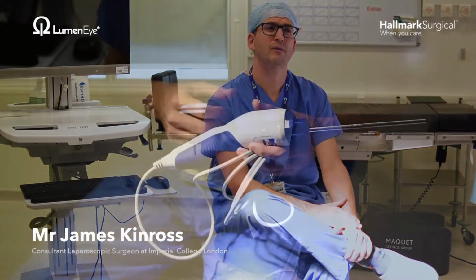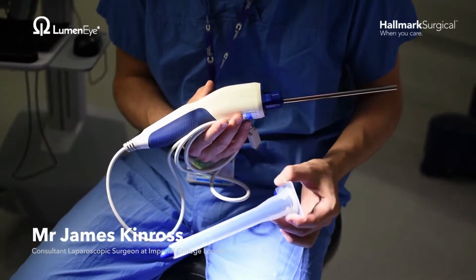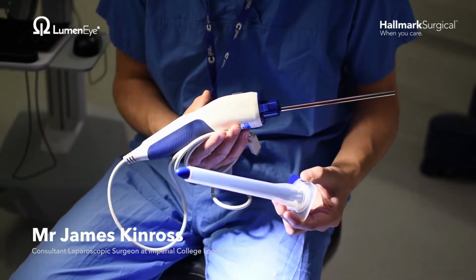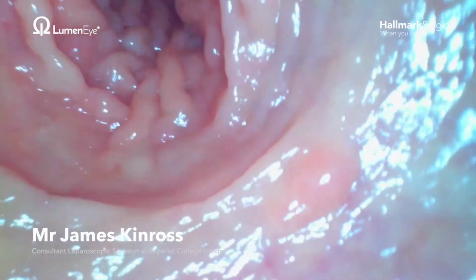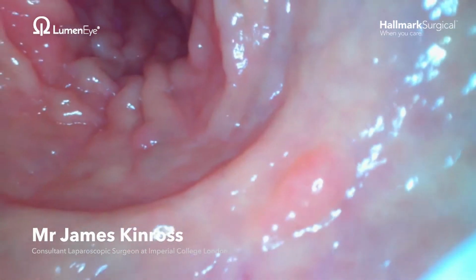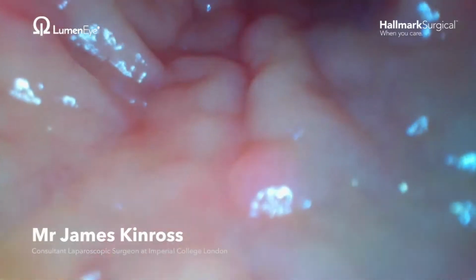So I often use this device as part of my initial clinical assessment, but I use it in other settings too. I use it in the assessment of rectal pathology, for example, complex polyps when I'm trying to make clinical decisions about management. And I also use it in the assessment of proctitis, inflammation, or conditions where I need to serially examine the rectum to tailor treatment. It's a very useful device in the management of benign disease. So we use it a lot in the treatment and diagnosis of simple conditions such as hemorrhoids. Patients greatly enjoy being able to see the pathology and to have an objective assessment of their clinical problem.